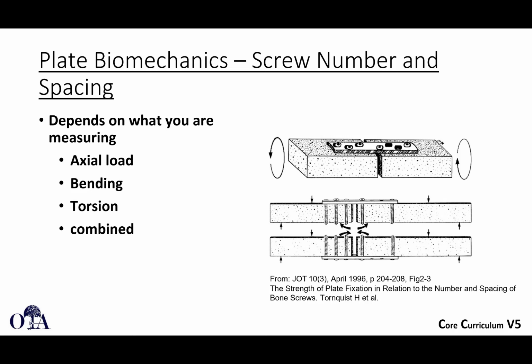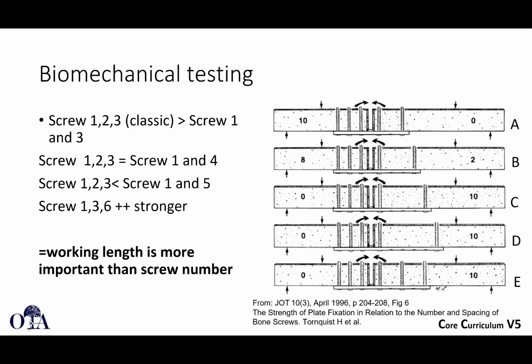So your screw number and spacing depends on what you're measuring. Is it axial load? Is it bending? Is it torsion? Is it some combination? So here are some examples of different constructs that you can create, and references below for you.